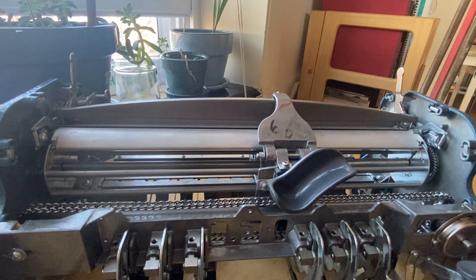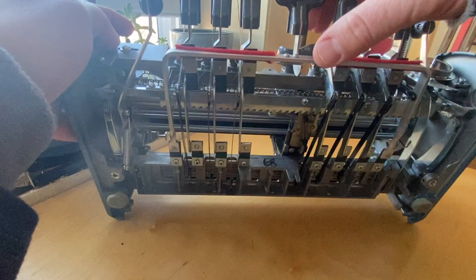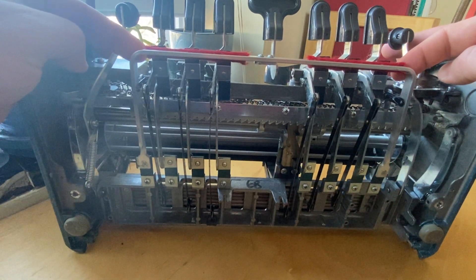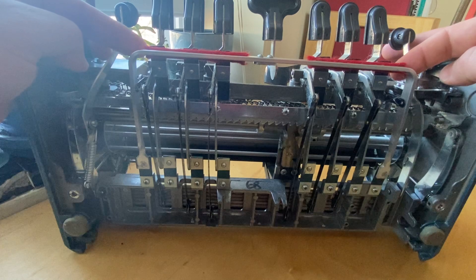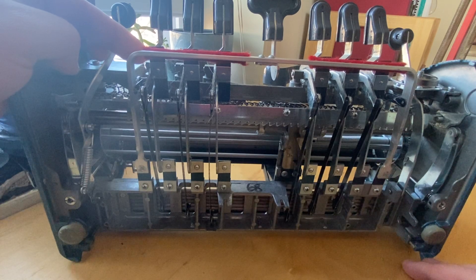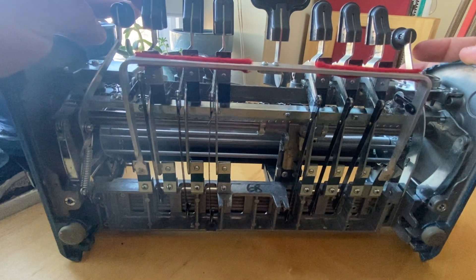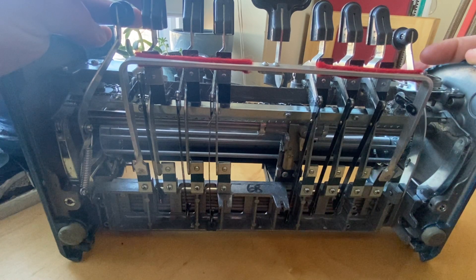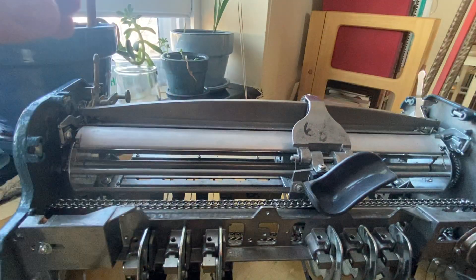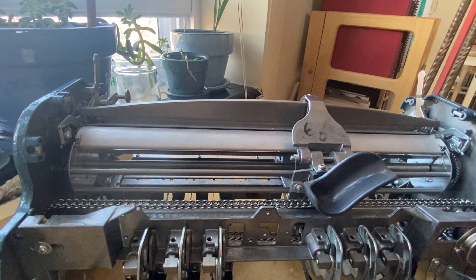The force to clamp that down is provided by pressing the space key or any of the other keys. The reason why the embossing head moves forward when you press any of the entry keys is because that U-shaped bar that the space key is connected to runs underneath all of the Braille entry keys. So when I press down any key, not only am I going to advance the embossing head forward, I'm also providing pressure to clamp down between the embossing head and the arch die box above it.